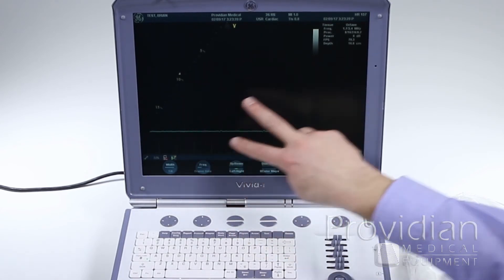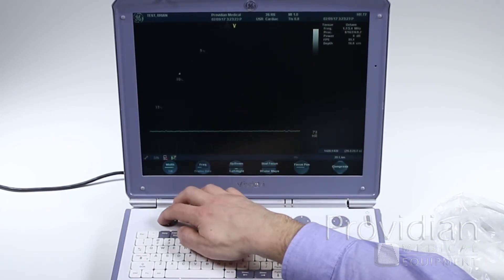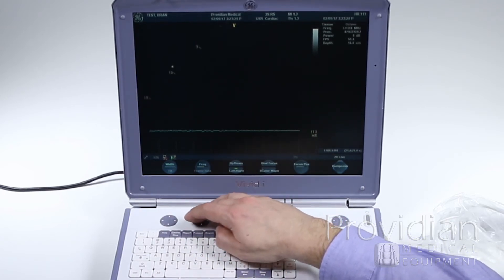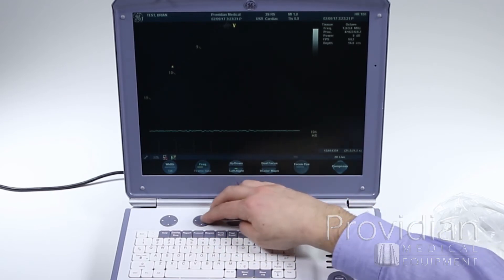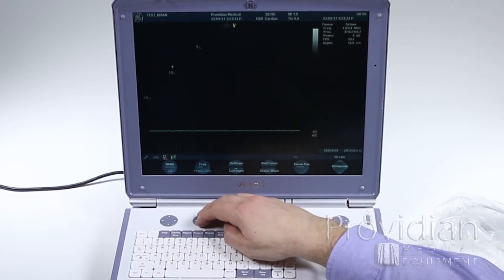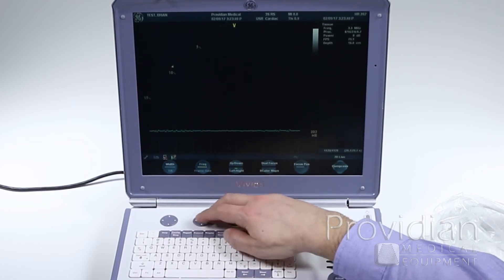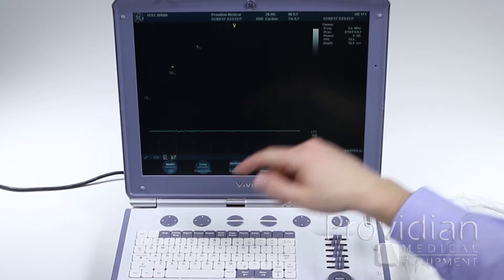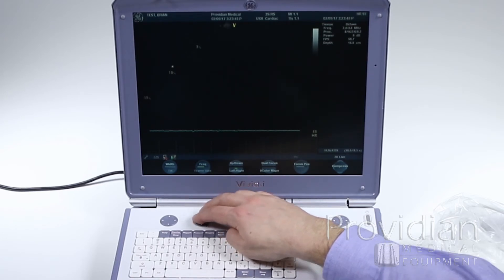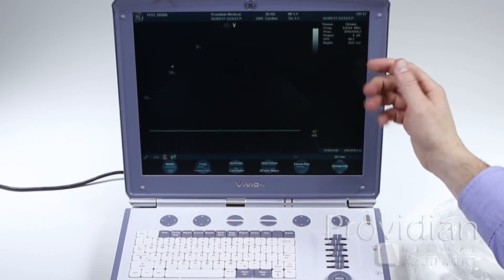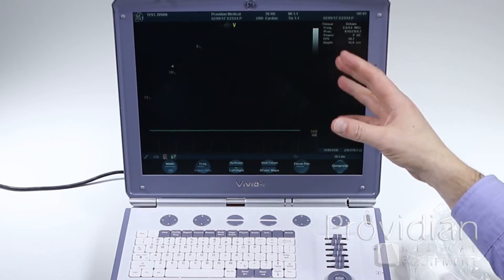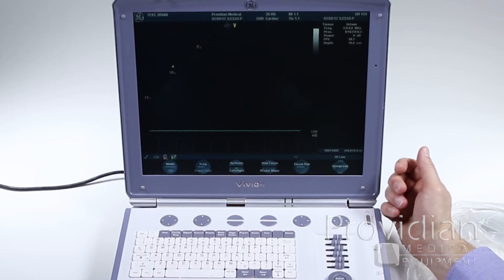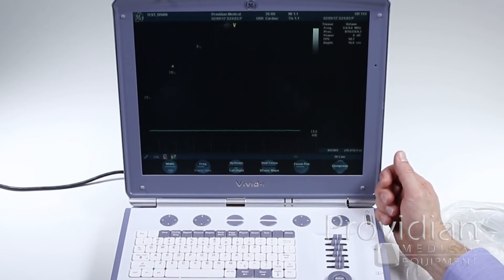Let's now go down through these soft keys. We can adjust the width of our sector, change the frequency. As I change the frequency, you'll see that it goes from octave to non-octave. And then it just shows me a single frequency, which is where it's sending and receiving. I'm at 3.6, which is the highest frequency that's available. If I scroll down, it's now going from 2 to 4. If you're familiar with harmonics, that's saying it's sending at 2 and receiving at 4 megahertz, which should theoretically give you a better image. If you're having trouble with penetration, you can always turn off that harmonics.